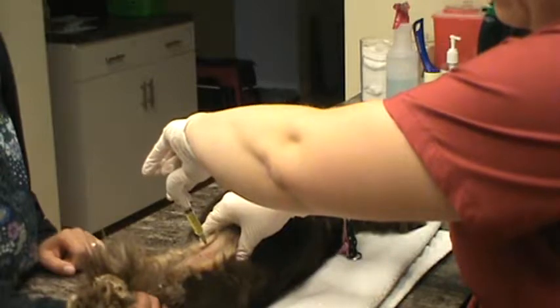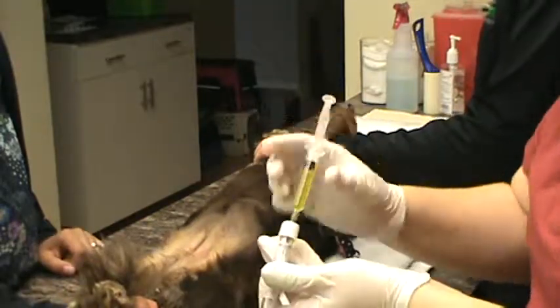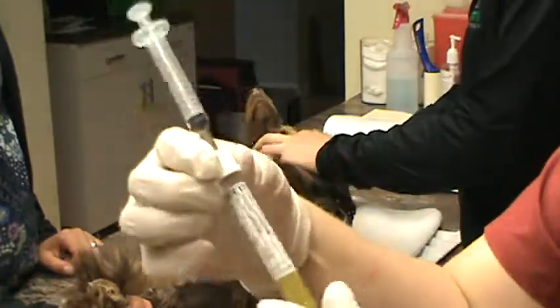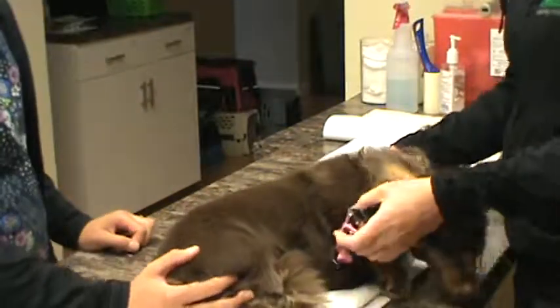And we're done with our sample, so I'm going to let go. There we are. I'm going to transfer that to our vacutainer, and it's properly labeled here. And they're going to roll the patient back over gently. And that was a cystocentesis.